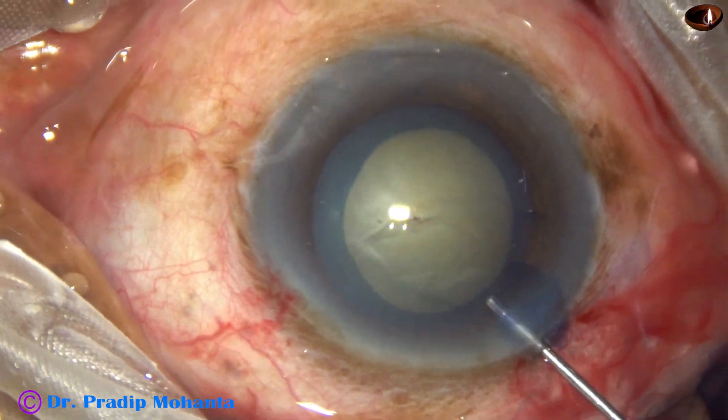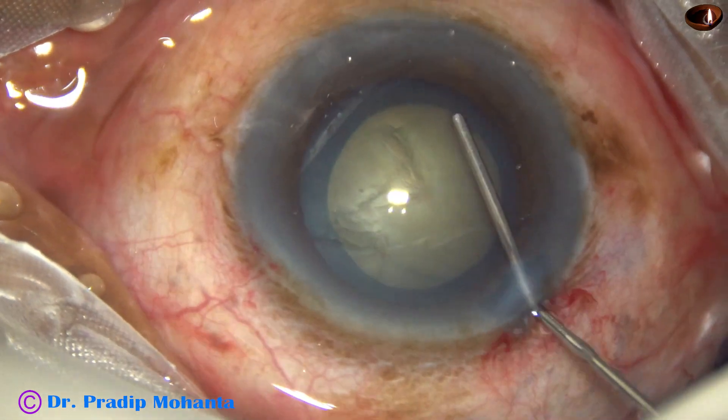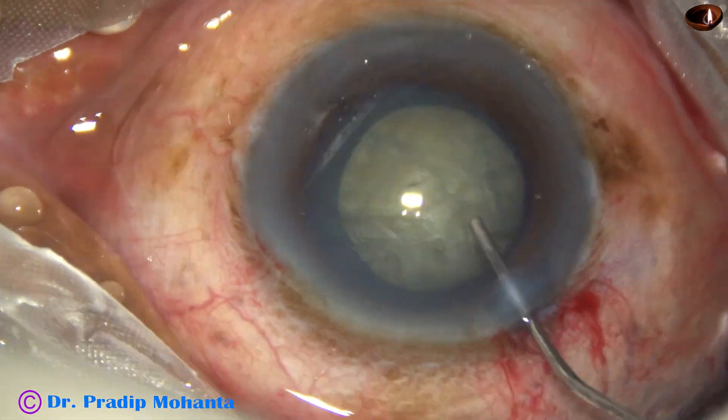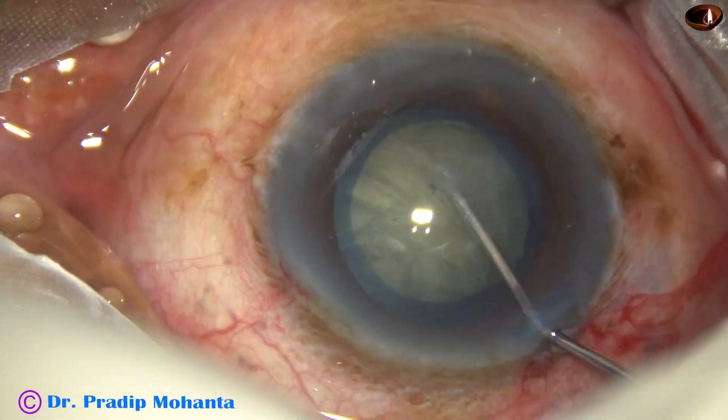And now, hydrodissection is done with a BSS and 27-gauge cannula. The lens mass is separated from the capsule.